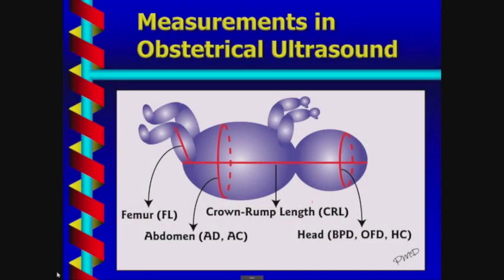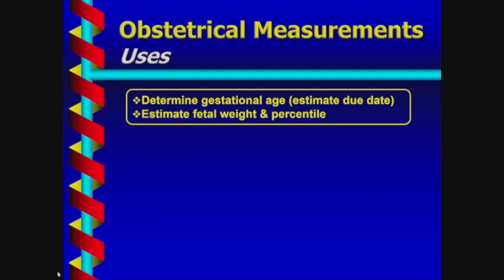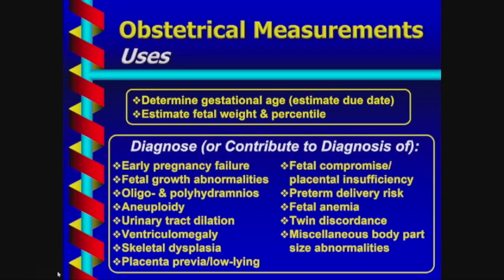So the main uses that we think about are determining gestational age, or estimating the due date, estimating fetal weight and percentile. But as I'm sure you know, measurements play an important role in many aspects of obstetrical ultrasound.